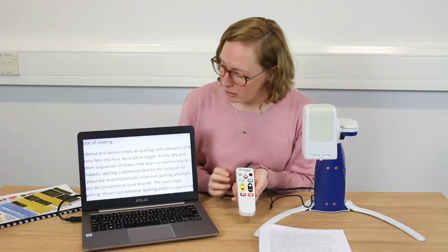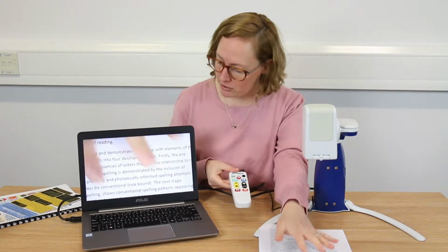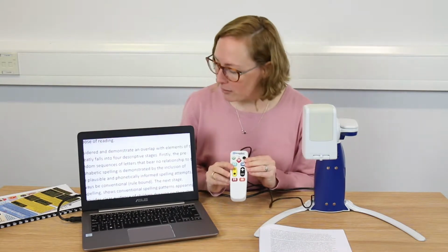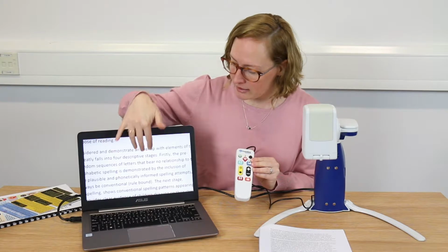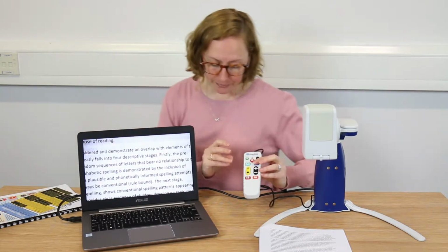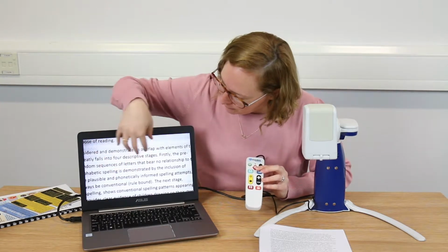Next to that, we have our colour contrast button. So again, you can change the colour contrasts of the image of the live view depending on what suits the user. So we've got almost like an HD type colour contrast here, but if I go through, we've got black on white.